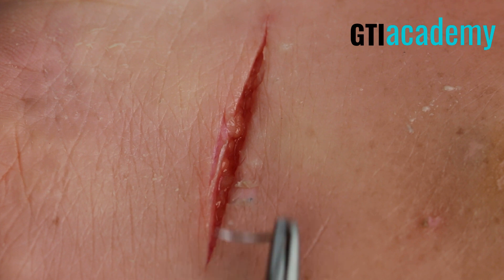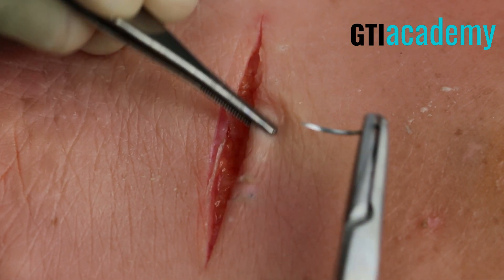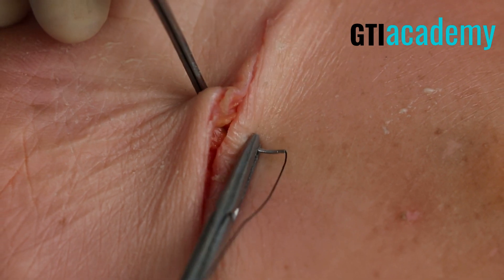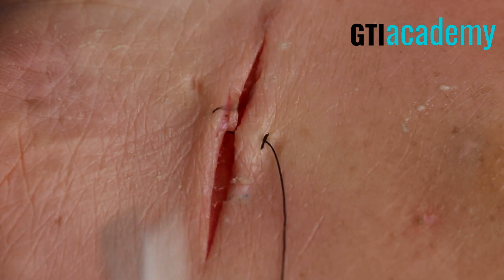For this simple interrupted suture, the first thing I like to do is throw a suture in the very middle of the wound. Look at the end and let's put one right in the middle. This will help approximate the wound but also keep equal distance in between each suture.